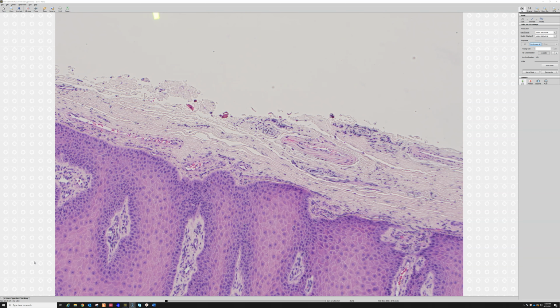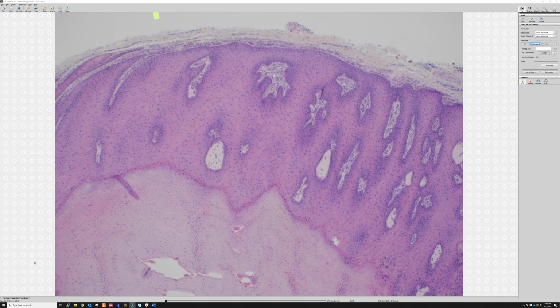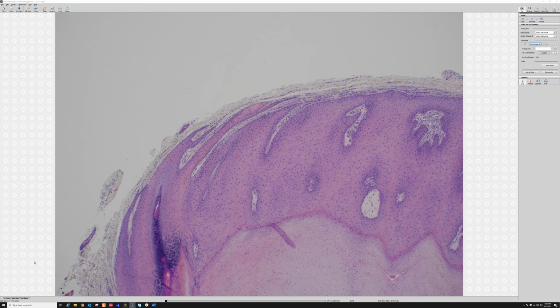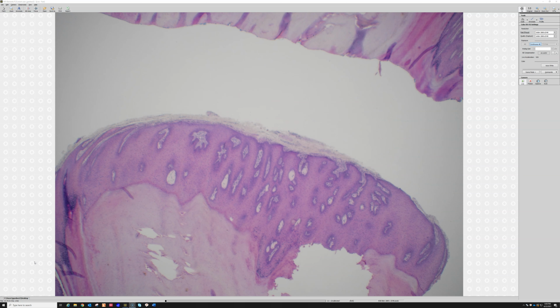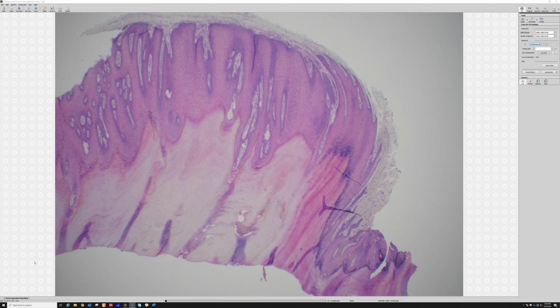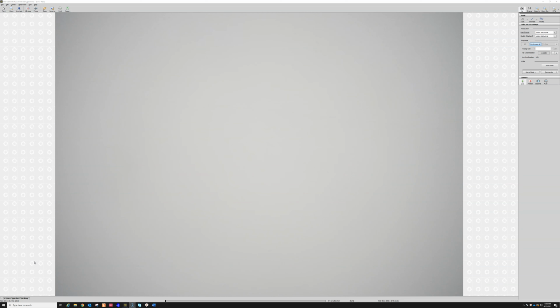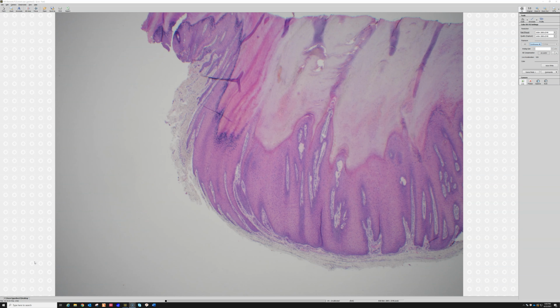Dermis does. I think someone tweeted one of these a while back and did a poll and asked if the lesion was the right way up or not, and I think the majority of people got it wrong. That's not to shame anyone who got it wrong. The point is that this is a thing people struggle with, because until you've seen this and had it explained, you'll be like, what is going on? Especially if you don't happen to get that little bit of epidermis there. If you just had a cut through here, you could have a hard time orienting yourself. And then all the features here are the same. Look at the interdigitating. Amazing interdigitating there.